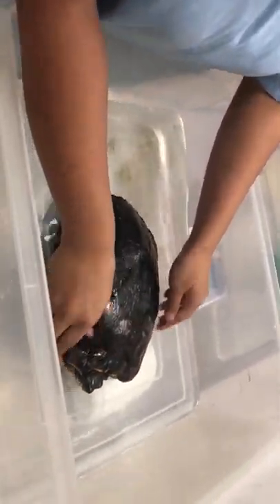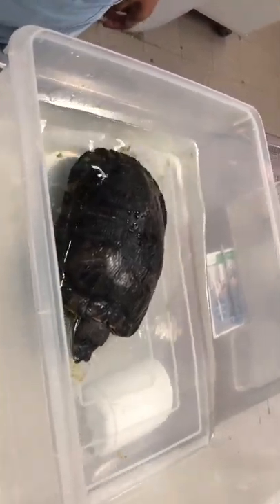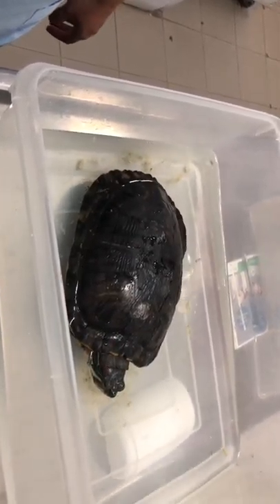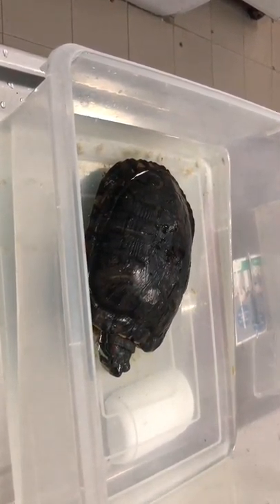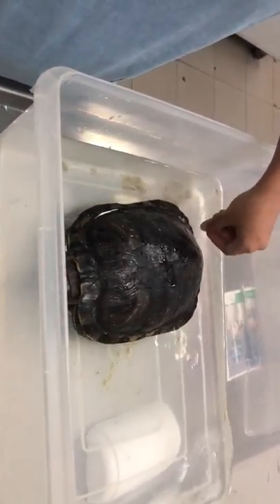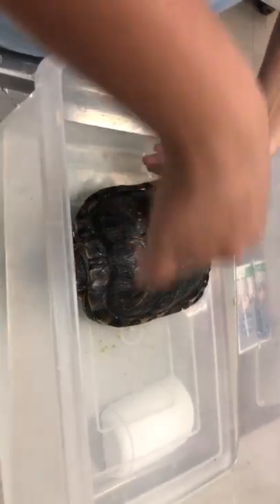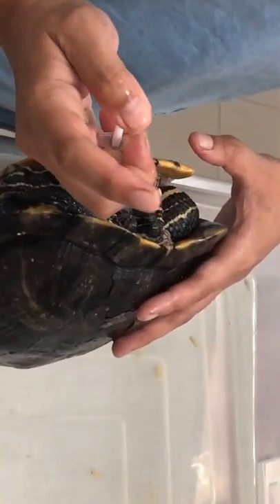After that, you need to put the terrapin back into the water so that he can swallow the food in the water. How long do you wait? About one or two minutes. After that, you need to repeat again. Open and then push the syringe in.